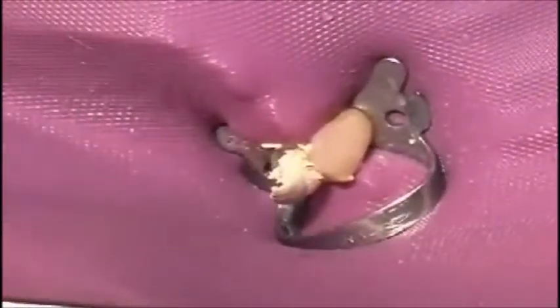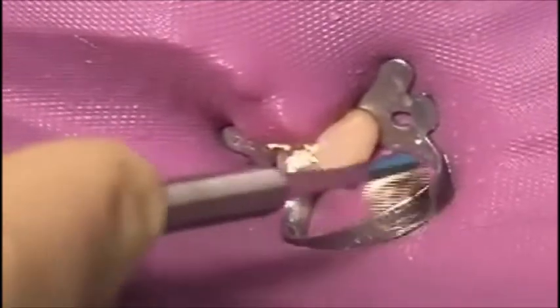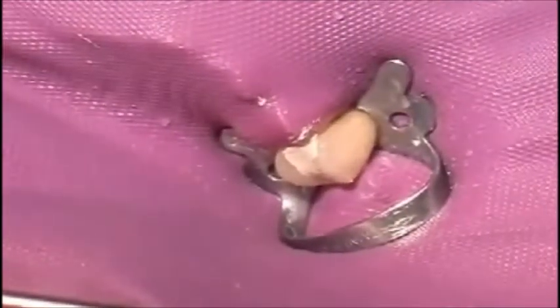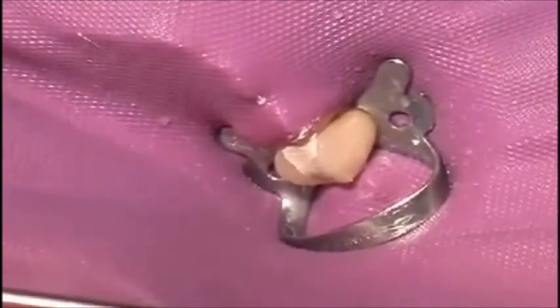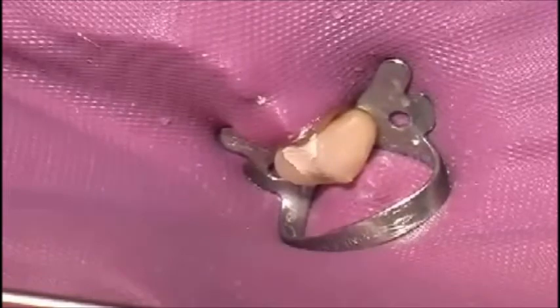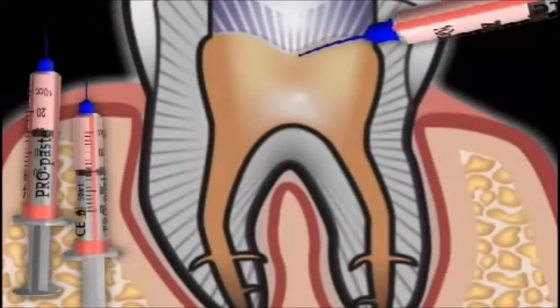However, the temporary sealing material must be absolutely saliva-proof. That's the gray compound seen in the image, as it keeps the tooth tight for about 1 week. Another session must take place no longer than a week after the initial session. Otherwise, bacteria from the saliva would enter the interior of the tooth, and the entire previous procedure would have to be repeated.